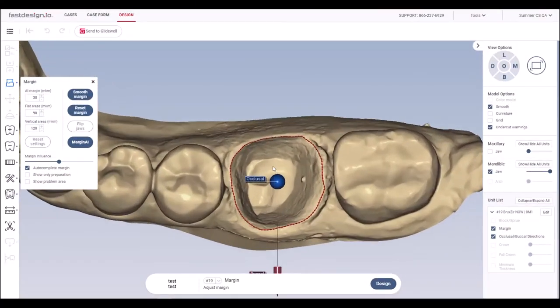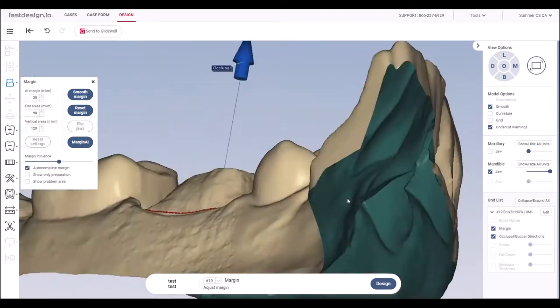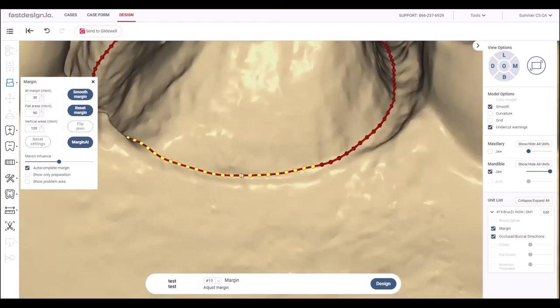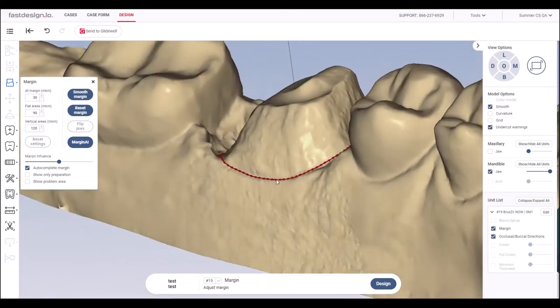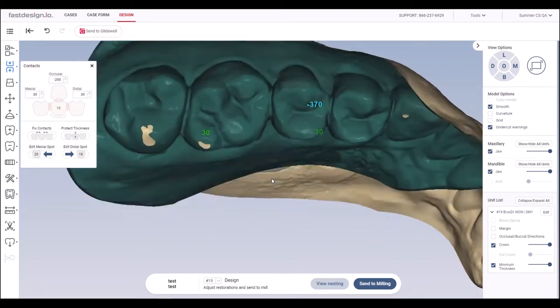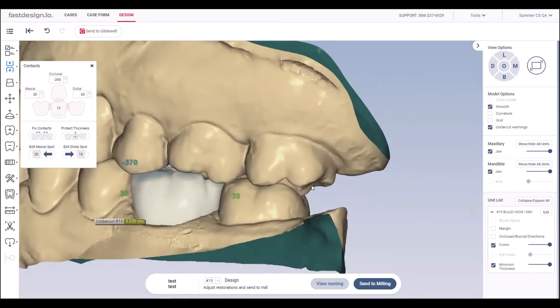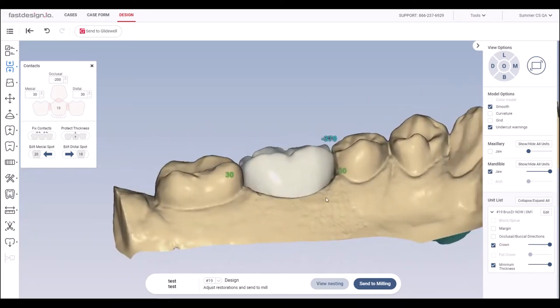The first step in the Fast Design software is margin marking. The margin is designated by the red dotted line. I rotate the model around to ensure the line is marked correctly. Once the margins are set, the software generates a functional and aesthetic design that fits the restorative space. Incredibly, the entire design process typically takes less than three minutes. I'm so grateful to the 60 software developers that dedicated over 700 man-years to create this very easy-to-use design software.